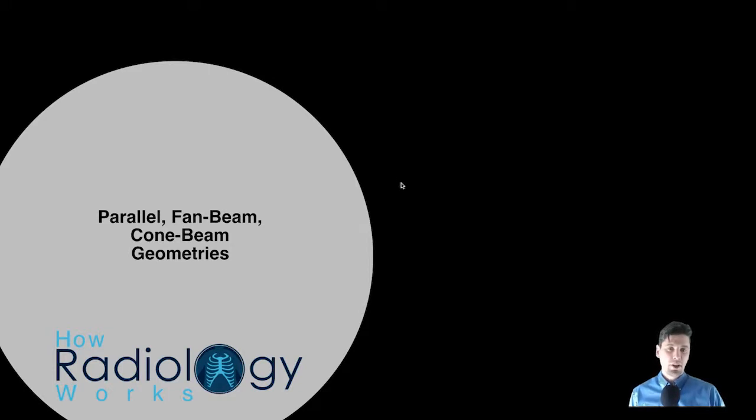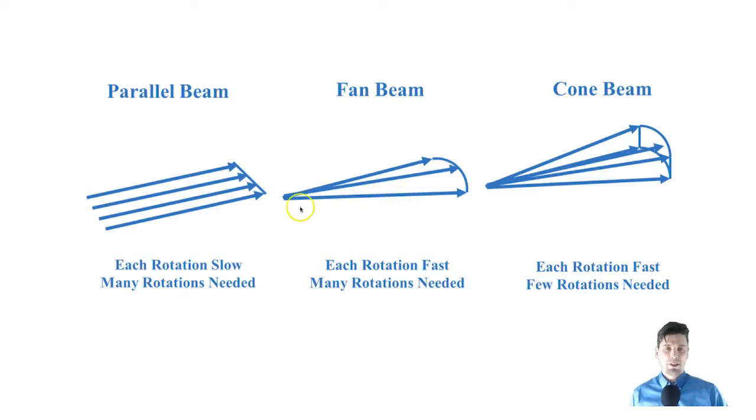At a high level today, we're going to talk about parallel beam, fan beam, and then cone beam geometries in X-ray CT and how these are different from one another. So parallel beam CT was the first generation of CT. We also have a series of these short videos on the generations of CT.